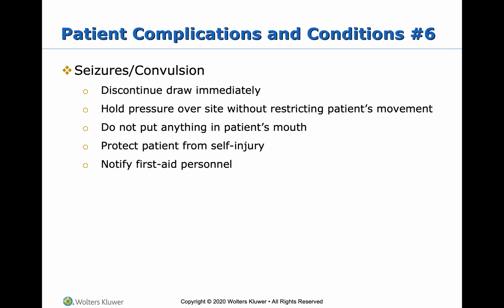Every single room has a call button or a pull string. You're going to push that call button or pull the string, and yell for help, okay? First aid personnel will come in and take over from there. So your job is to call for help in a situation like this, discontinue your draw, and put pressure on the site so that they're not bleeding all over.